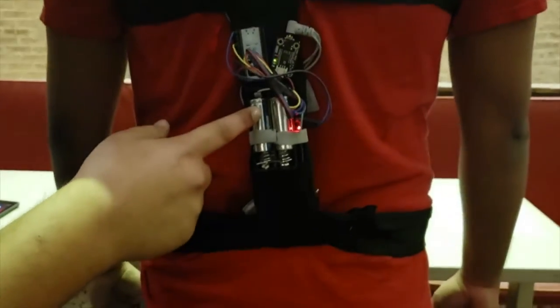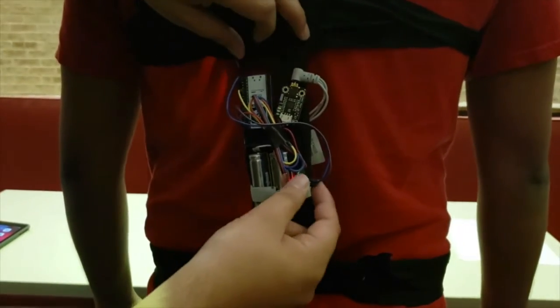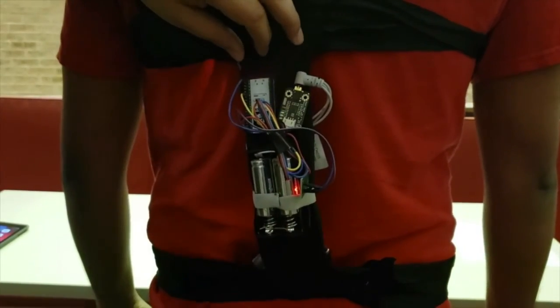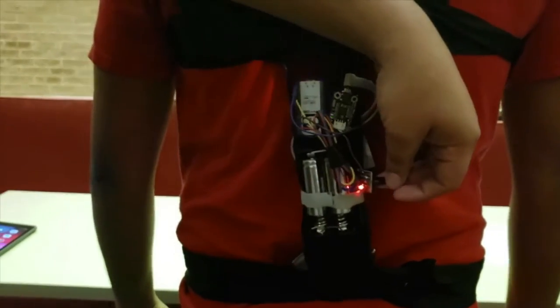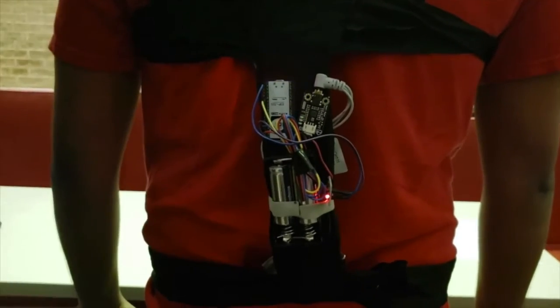Here you can see our battery pack. It is two 1,000 milliamp-hour lithium iron phosphate batteries. Here you can see our boost converter, which converts the battery from 3.3 volts to 5 volts and powers the entire system.